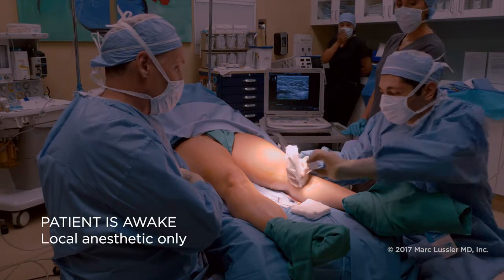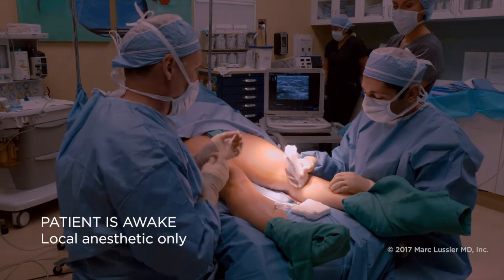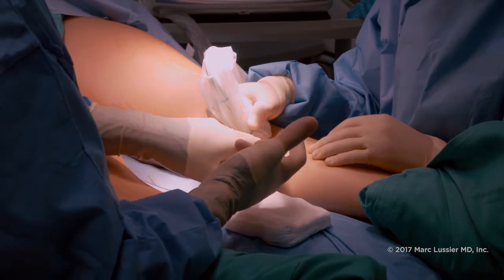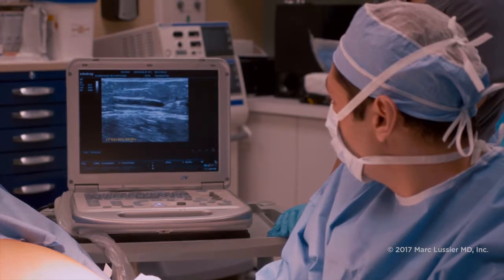Surin has now identified where the vein is and he's going to direct me. I'm first going to numb her up with some lidocaine. Under guidance, we're going to do a little poke and then we're going to see the needle approach the vein.